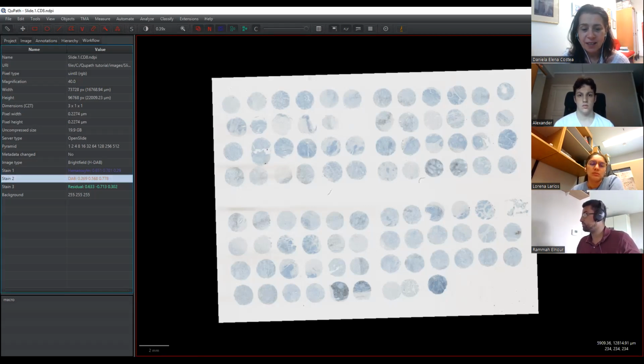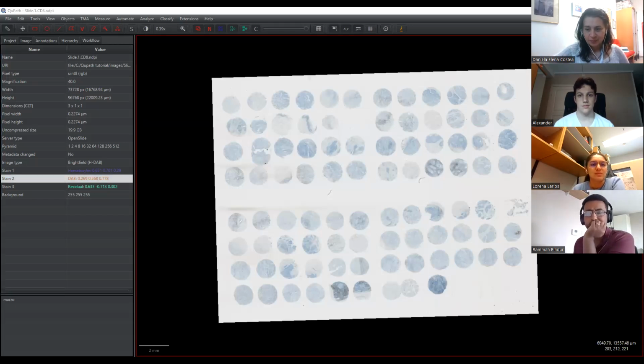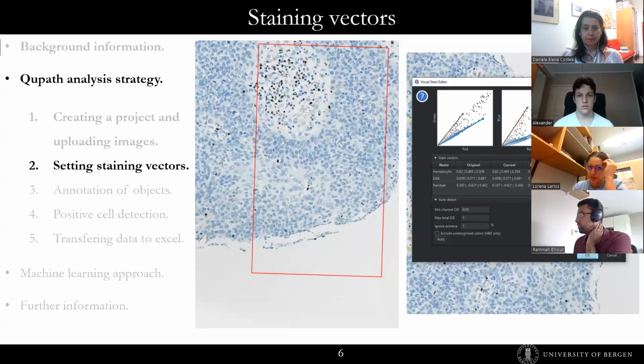So if I go into QuPath, yes? Sorry, we are still seeing your QuPath, not the PowerPoint. Okay. This is okay. Let me see if I can sort that out. I don't know why it's doing that. Maybe now it could be better. Now, do you see the slides?